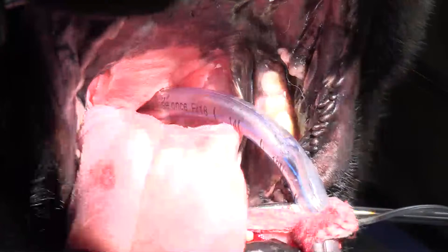We'll just have you pull the tongue down here — just grab the tongue like that — and see if that improves our view a little bit.